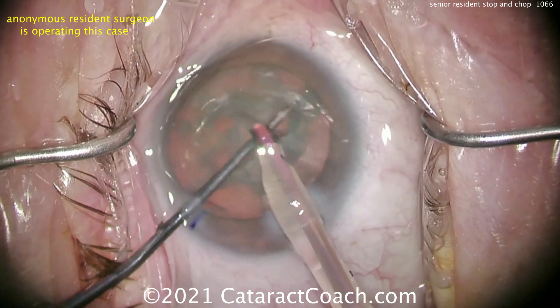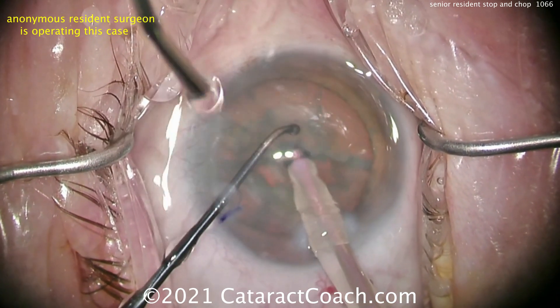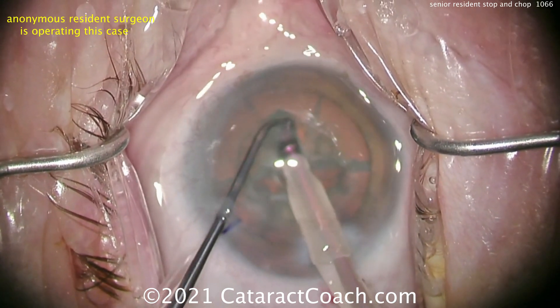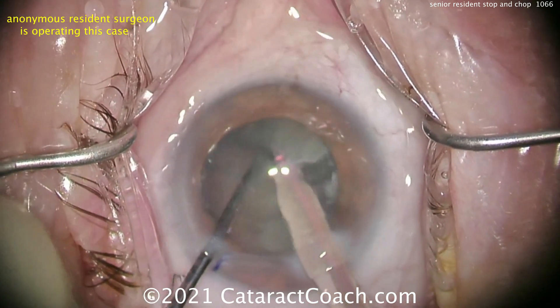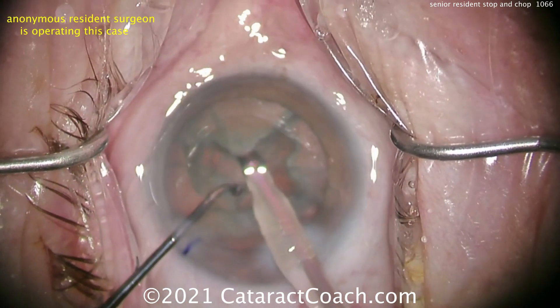The eye's drifted a little bit towards the nasal canthus, but not too bad — this is actually quite a good job. Let's see the attending squirting the eye. Let's see if we get the second chop in, and the chopper goes around. Pretty good. You've got four quadrants — take them down. Very nice technique here. I like the position of the phaco incision versus the paracentesis — about two and a half clock hours apart. That's just about perfect.